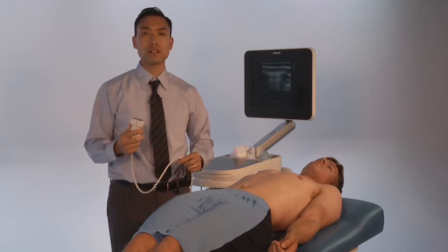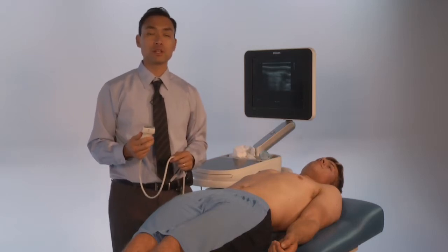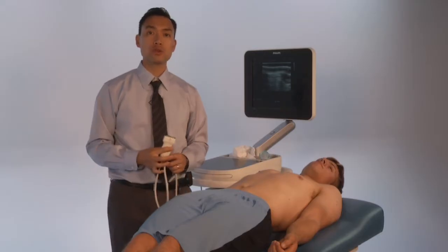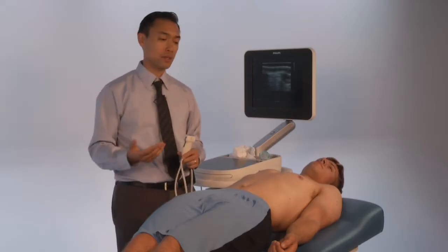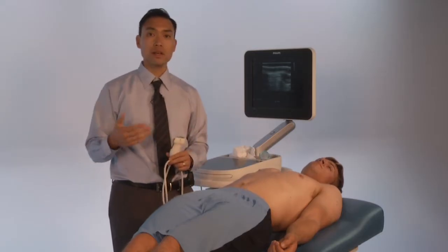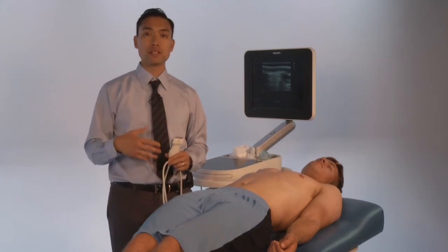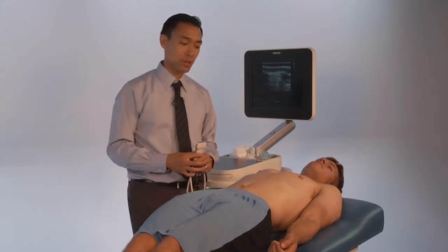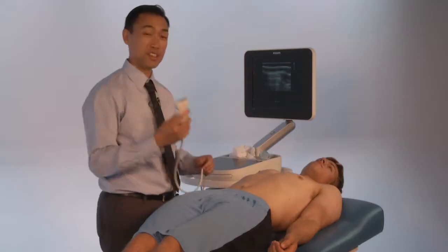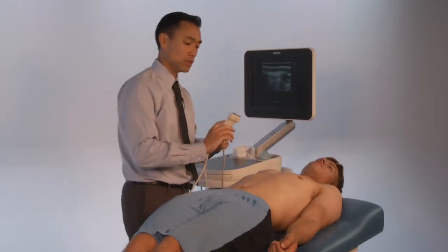Now we're going to assess how to look at vessels using color Doppler, and we're going to use two vessels as an example: the radial artery and the brachial artery, just to get a sense of how color Doppler works. We're going to use a linear probe because these arteries are superficial structures.